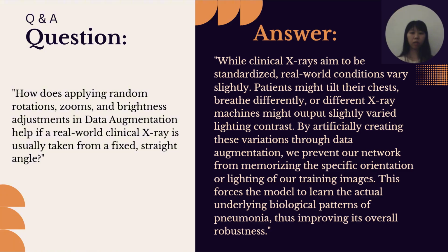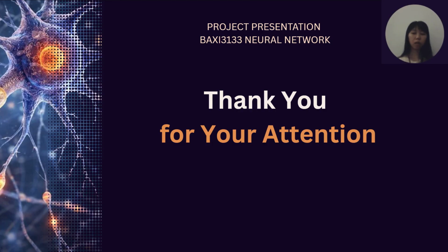Our answer is, while clinical X-rays aim to be standardized, real-world conditions vary slightly. Patients might tilt their chest, or breathe differently, causing a shift, or different X-ray machines might output slightly varied lighting and contrast. By artificially creating these variations through data augmentation, we prevent our network from memorizing the specific orientation or lighting of our training images. This forces the model to learn the actual underlying biological patterns of pneumonia, thus improving its overall robustness. That concludes our presentation on deep learning for pneumonia detection.